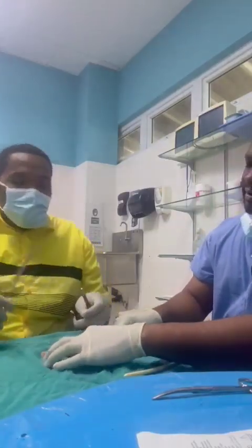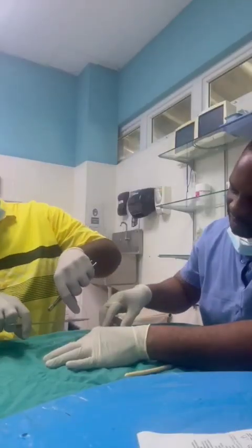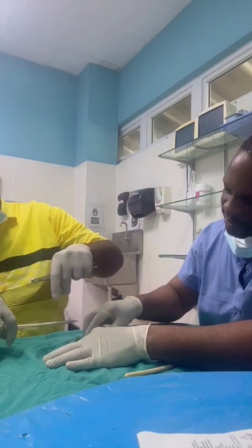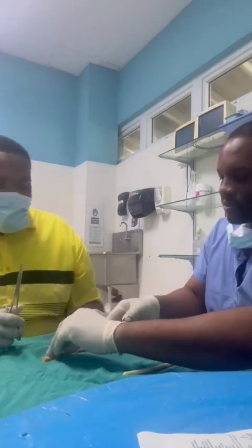Excellent. And how would you like me to cut the suture? Cut it 1 centimeter from the knot. Oh, very good, sir. That's brilliant. Okay. Thank you for that.